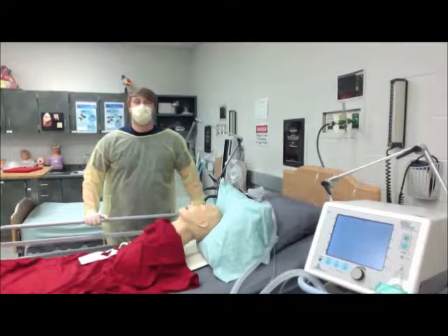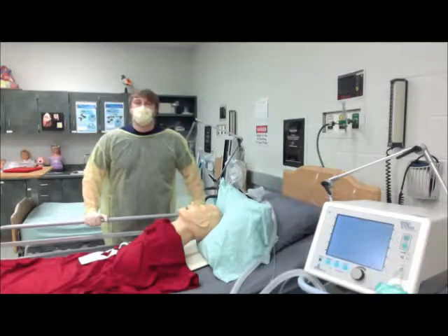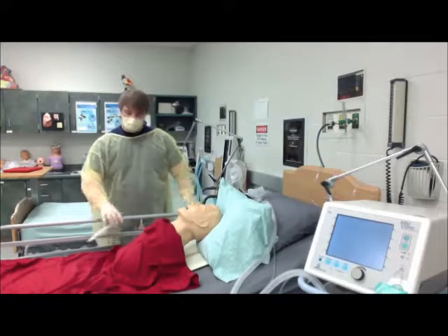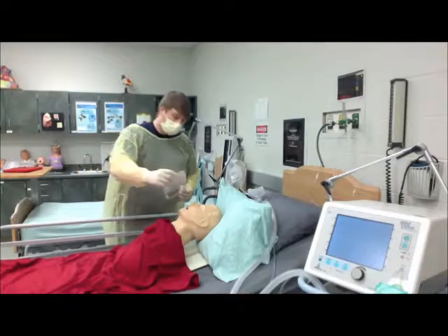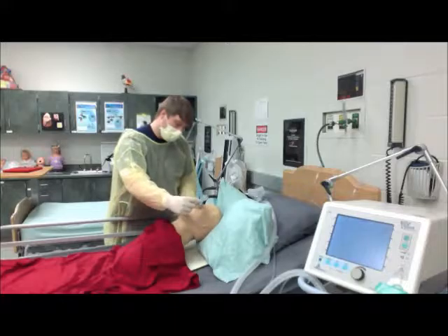So I spoke to Dr. Nose after looking at Mrs. Tubbs' ABG, and we've come to the conclusion that she needs to be on BiPAP therapy. So the first thing we need to do to help her spontaneous breathing, to get her on the BiPAP, is we need to measure for the mask. So it looks like she's about a medium face mask.